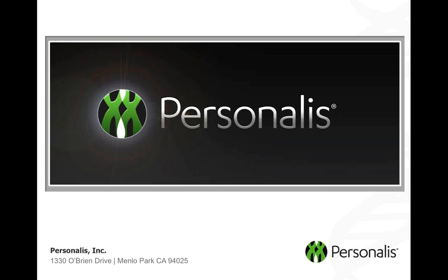What sample type do you tend to use for the normal sample in your ACE assay? We use a whole blood type as a normal type, but we also have a proxy normal database that we've developed and established at Personalis, and that's unique to Personalis, using a panel of normal samples.